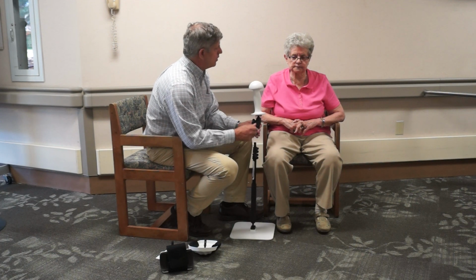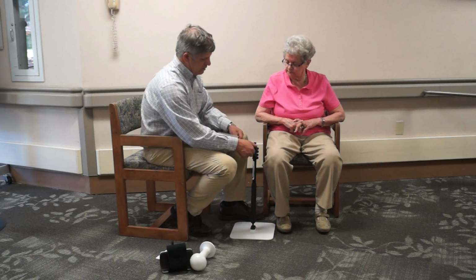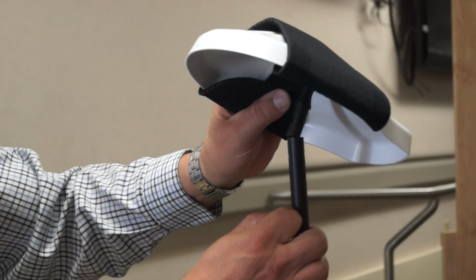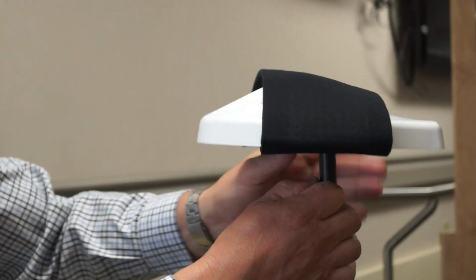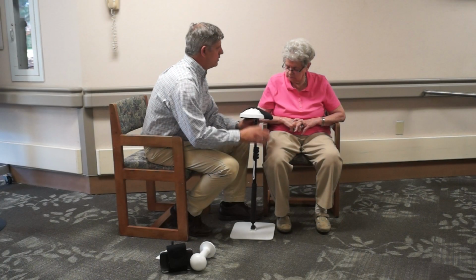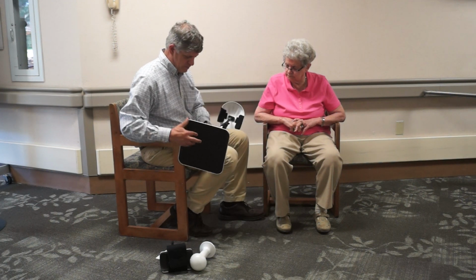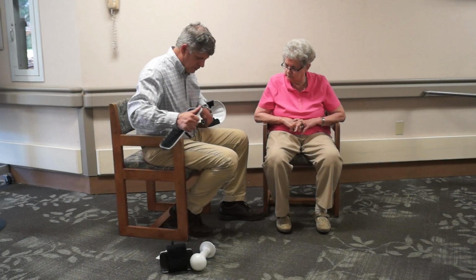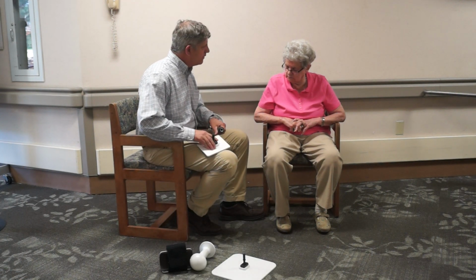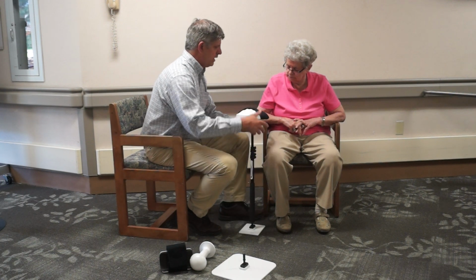Okay. So I'll ask you one more time, just bring your spine a little straight. Stand a bit more erect. That just helps your shoulder be in a better position, okay? All right. So here's the change. So we're going to change this one out. And we're going to put this open hand here. But this will give you a little bit more challenge so that you can use your forearm a little bit too, okay? But I'm also going to take the base off. So this portion can come off as well. And this one has more mobility to it, okay? Okay. So that's going to ask more of your muscles, all right?